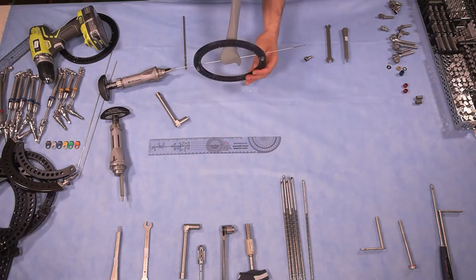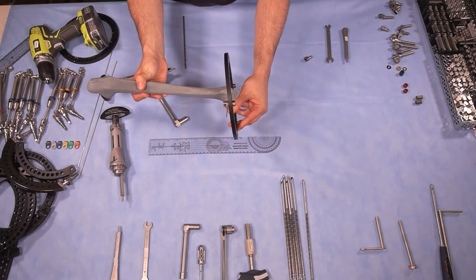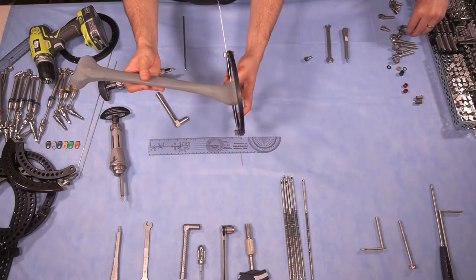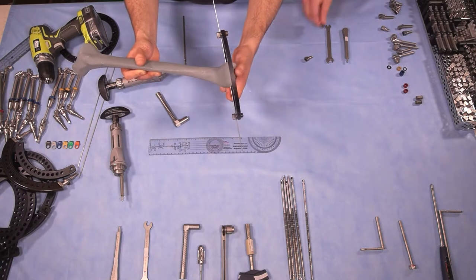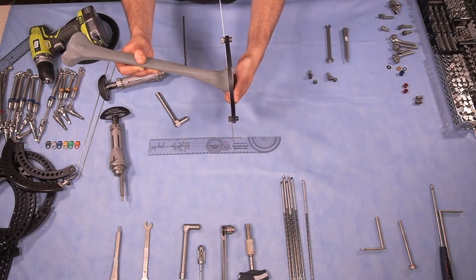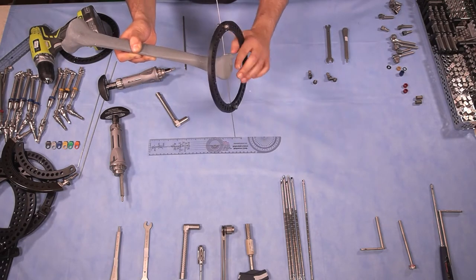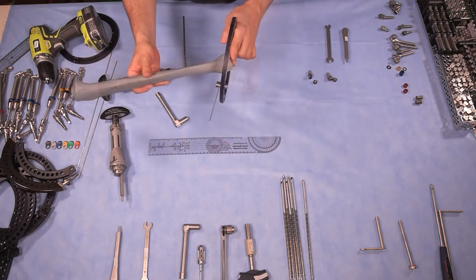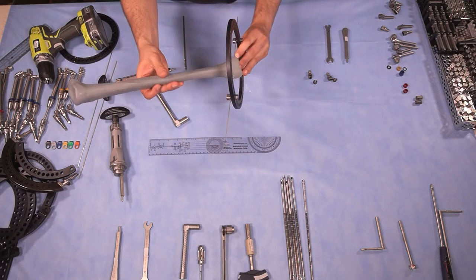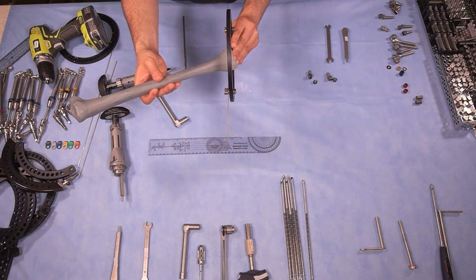We are now going to fix the ring in the sagittal plane by suspending another wire. If we want to be perfectly orthogonal to the distal portion, we should apply about nine degrees of divergence between the joint line and the ring. However, you're also constrained by the soft tissues. In this particular system, you can angle the sagittal plane to clear the soft tissues of the foot.